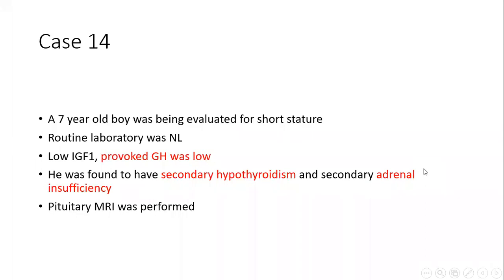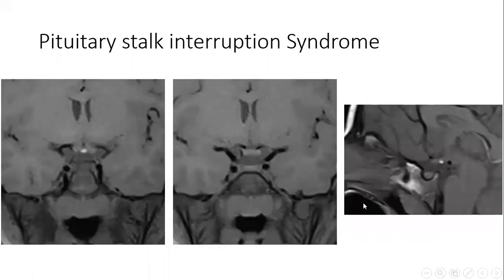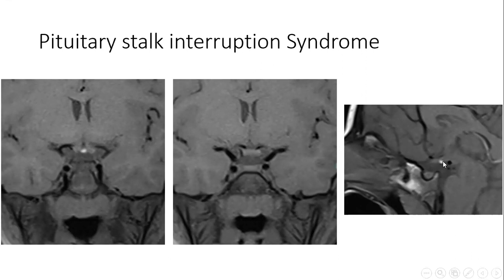The last case: a 7-year-old boy evaluated for short stature. Prolactin was normal, IGF-1 low, provoked growth hormone low, secondary hypothyroidism and secondary adrenal insufficiency. Pituitary MRI shows absence of the pituitary stalk, a small anterior pituitary, and a bright spot at the origin of the pituitary stalk — actually the ectopic posterior pituitary. This case was pituitary stalk interruption syndrome.